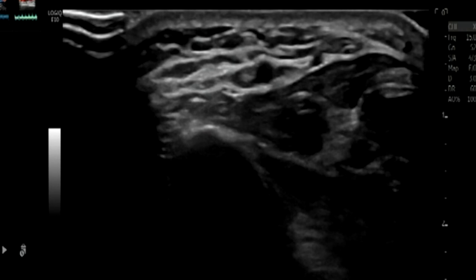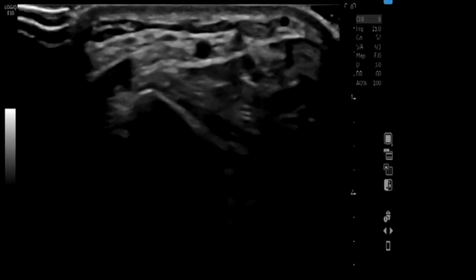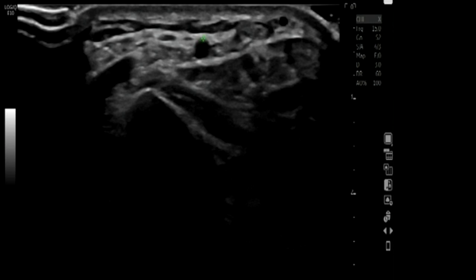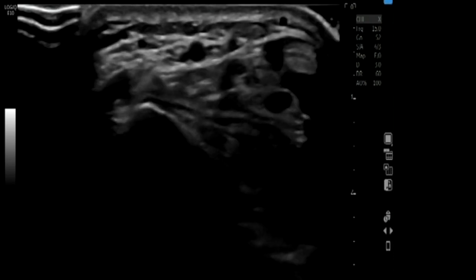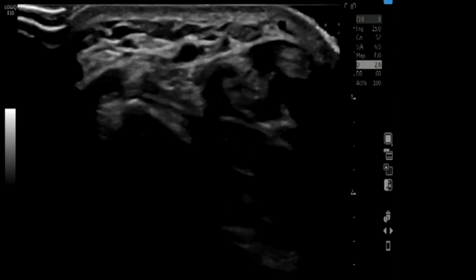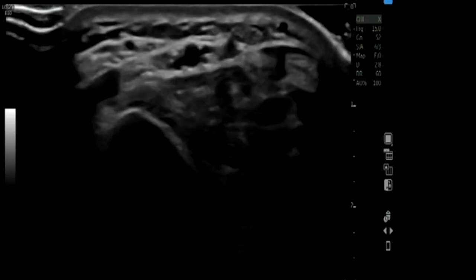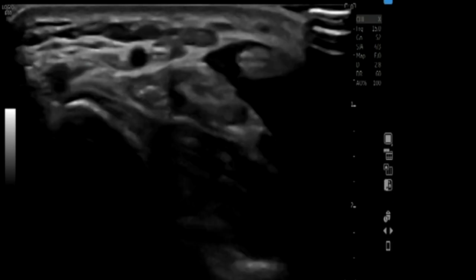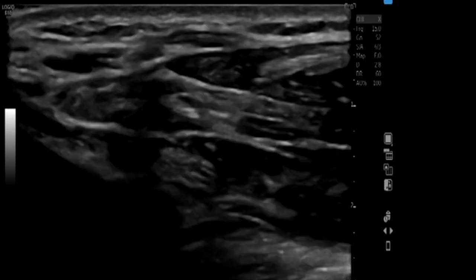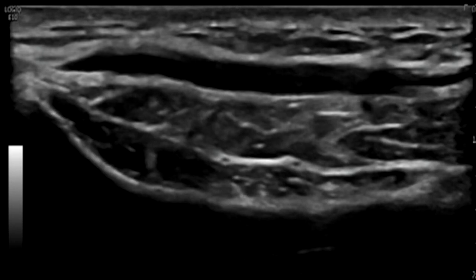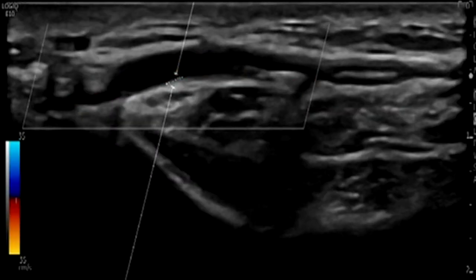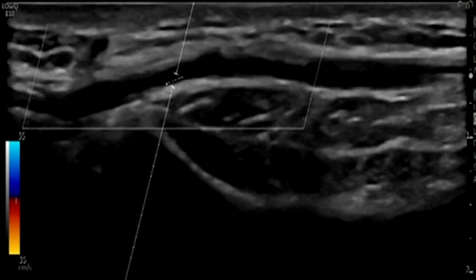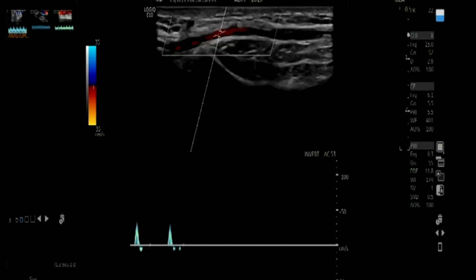Before confirming the feeder artery is healthy enough, do a good B-mode scan and measure the artery lumen diameter. Here the artery is approximately 2.1–2.2 mm, which is sufficient. The cutoffs given in literature are around 1.6 to 1.7 mm, and in the Indian population you don't often get arteries bigger than this. After B-mode evaluation of the radial artery, proceed to proper Doppler insonation, keeping peripheral gains slightly higher.